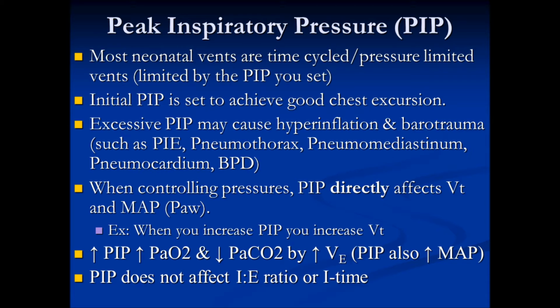go-to setting when you are talking about changing ventilation, whether to increase it or decrease it, because it directly affects tidal volume and also affects your mean airway pressure. So if you increase PIP, this will also increase your PaO2 and decrease your CO2. The reason why increasing your PIP affects oxygenation, such as your PO2, is because it is directly affecting your mean airway pressure.